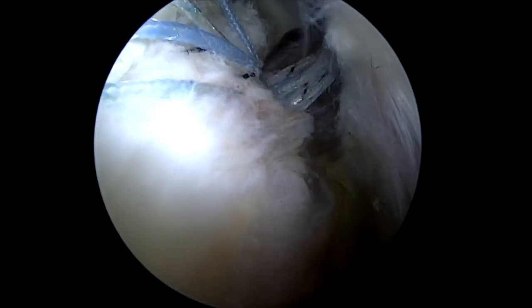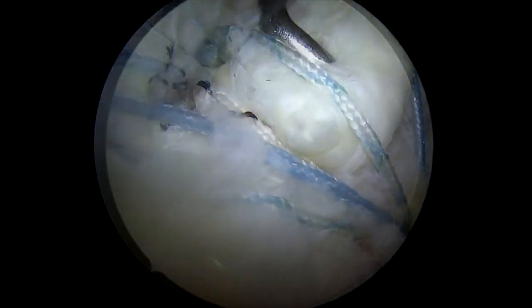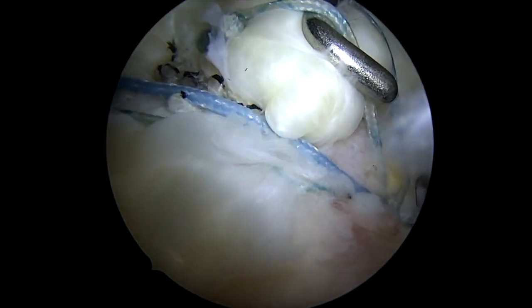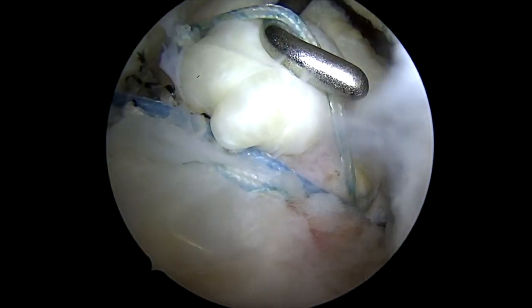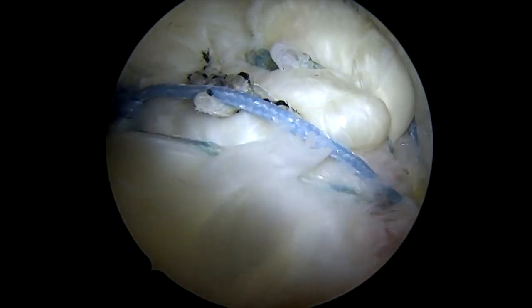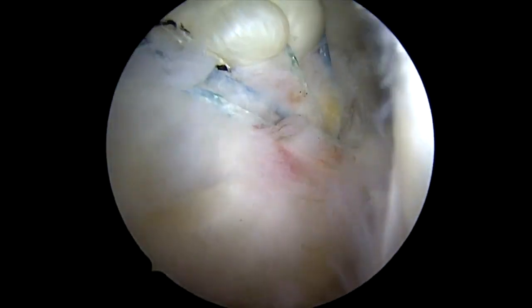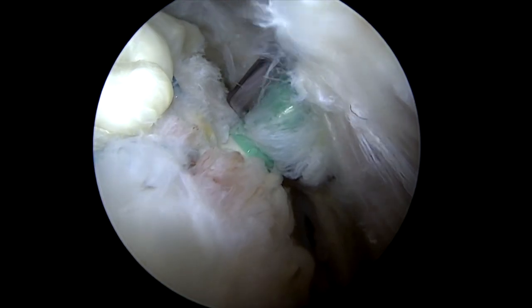Here's the anchor going in. As we do this, I may do a little bit of fine-tuning with the probe here to make sure that I've got maximum spread on my sutures and make sure that compression is evenly applied across the tendon surface. The probe allows you to fine-tune that as you go. Bring the probe out once we're pulling that down, and you can see how that makes sure there's no dog ears whatsoever — the tendon's nicely compressed against the footprint. That looks pretty good here from the bursal side. We'll insert our anchor and cut the sutures and take one final look.